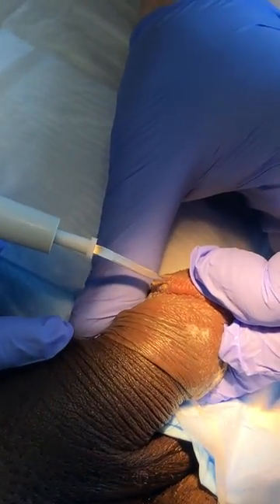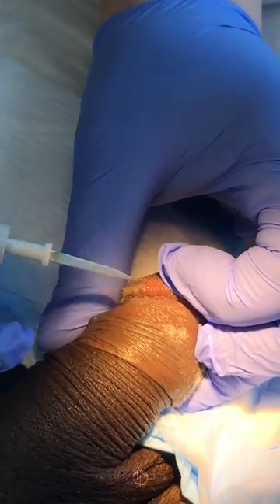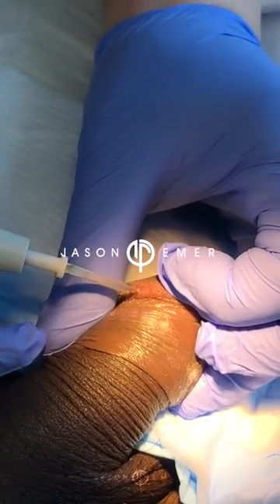So this is a hyfrecation needle for the treatment of penile pearly papules, a benign condition on the tip of the penis.